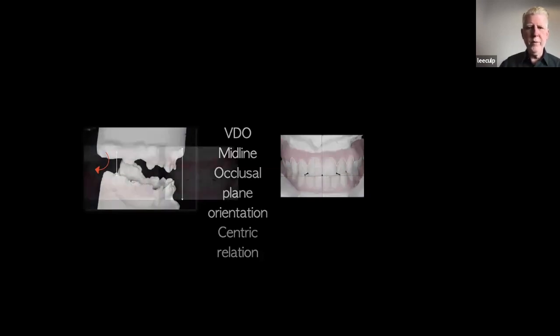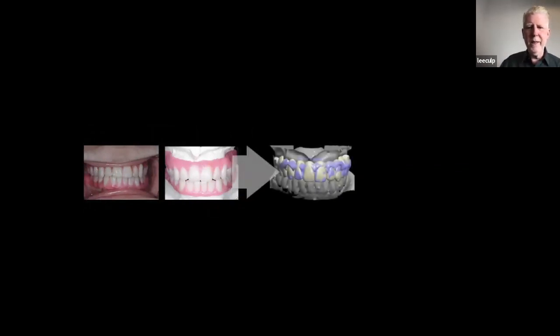And the gingival. Okay. So quick wax up in the mouth. Everything looks good. He likes it. He sends the data to me and I start to digitize. So what I did was I really just took the data once I had the teeth in position like I wanted them to. And again, we're going to use that cut to gingiva tool.